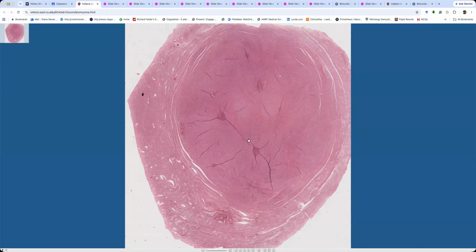We now have ischemic necrosis and tumor type necrosis. And the tumor type necrosis is the small bits of necrosis without the hyaline around it, right? Whereas the ischemic necrosis is large blocks of ischemia with hyaline fibrosis, smooth fibro, that acellular fibrosis around it. Okay.